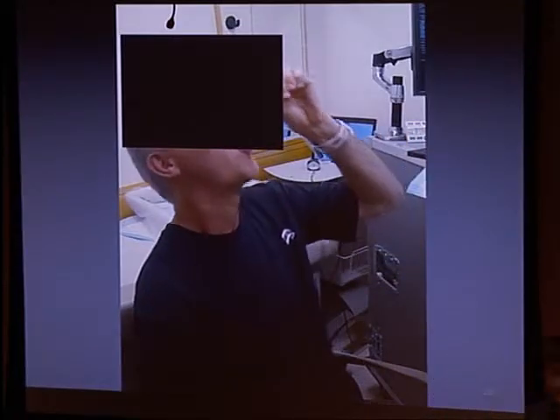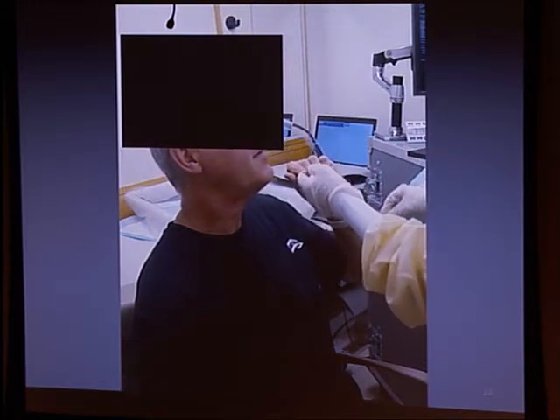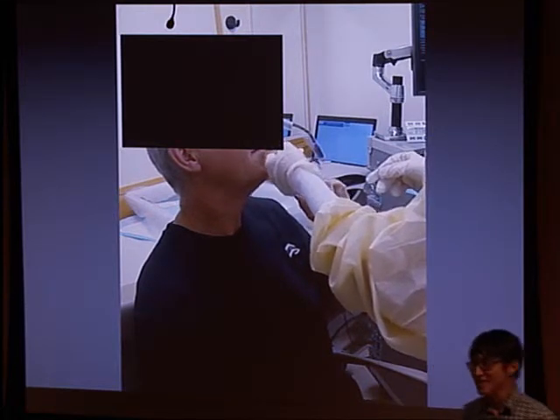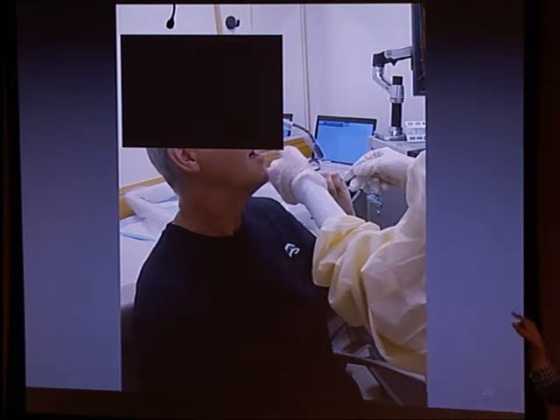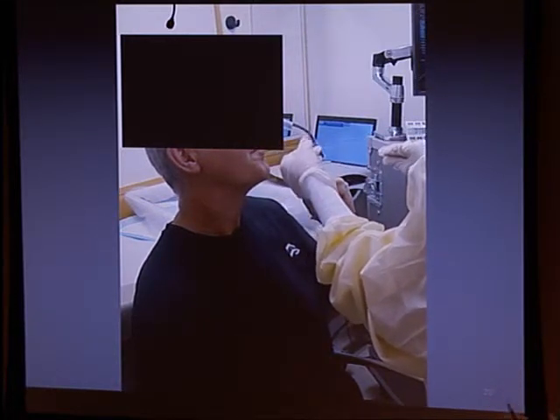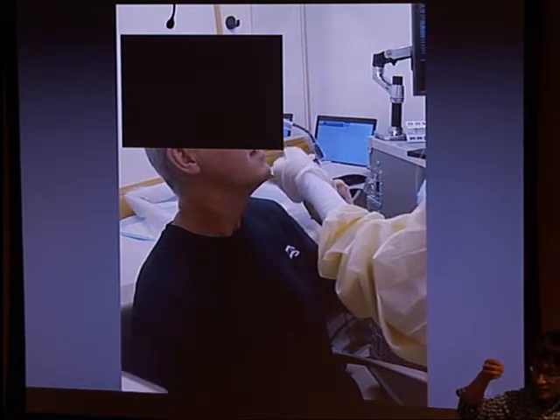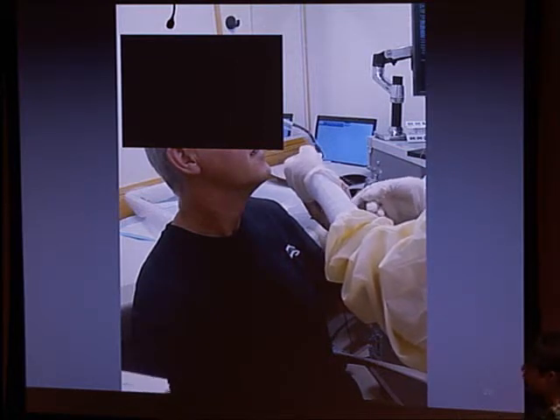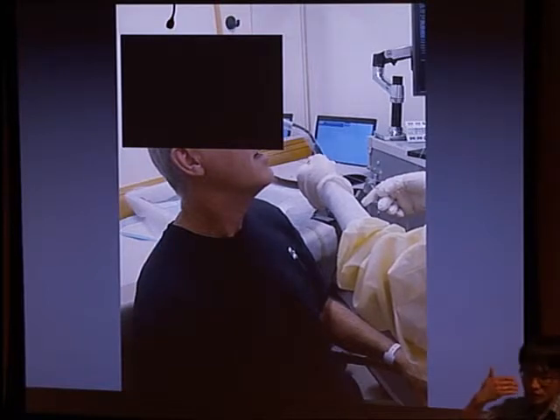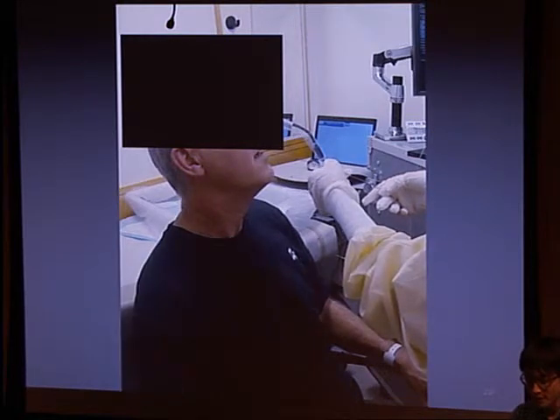And what you can do is ask the patient to swallow it. People do that all the time. Once it's in, your esophagus thinks this is just something to eat, and it pulls it down. Because of the peristaltic movement, the capsule device goes down, and then the operator pulls it back to scan back, and we do this down and up scanning 4 times to cover a large area of the esophagus.